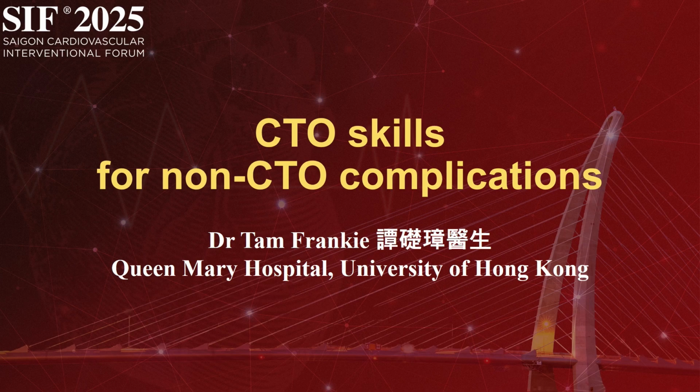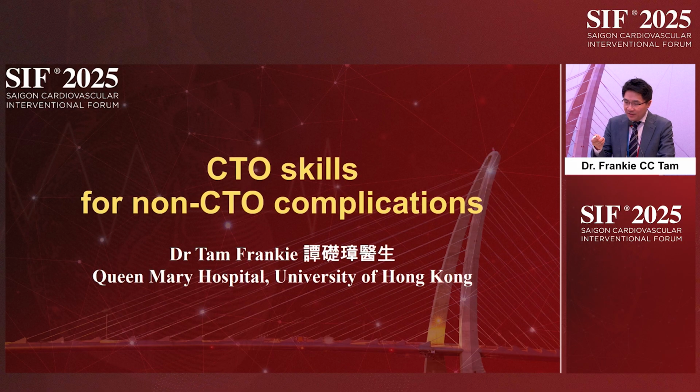So it is my honor to be here to share this case with you. I'm Frankie from Hong Kong, and thanks for inviting me. I'd like to show a case of complication and how to use CTO skills for non-CTO complications, right?